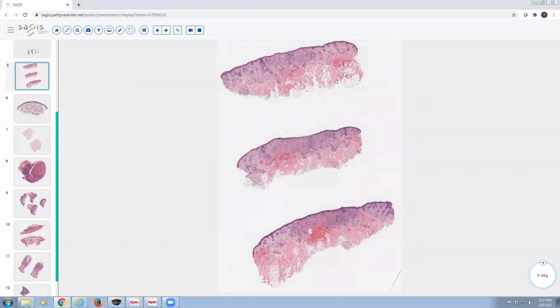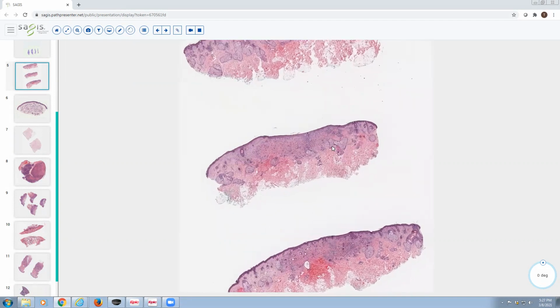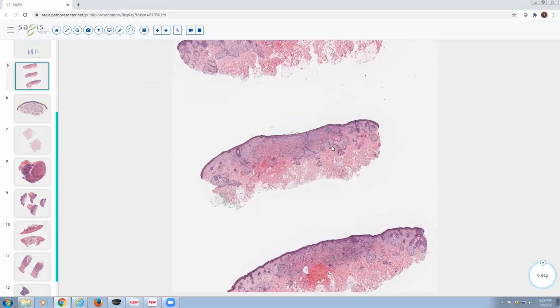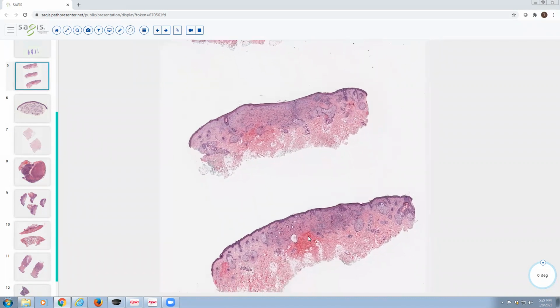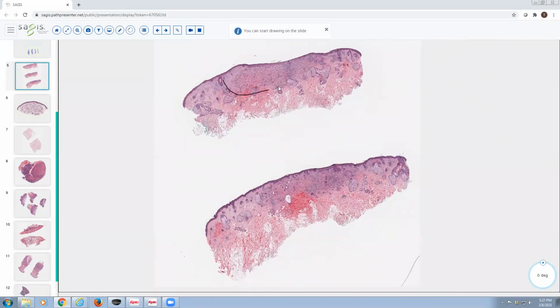This is a desmoplastic trichoep. So this one's a little bit different from the conventional or traditional trichoepithelioma because the tumor strands, instead of being small nodules, are really like thin cords and strands. So, like I mentioned earlier, it's really important on scanning magnification to get a sense of the architecture, especially the circumscription and the depth to which the lesion extends.